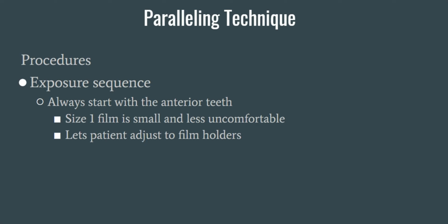It also lets the patient adjust to the film holders in their mouth. It's kind of bulky in there, and so some patients tolerate it well and some don't tolerate it as well. So doing the anterior first will help them adjust to having that in their mouth. And it's also less likely to cause a gag reflex. It lets the patient adjust to the film holders, so they're used to it being in their mouth, so it's less likely to cause that gag reflex because they know what to expect.